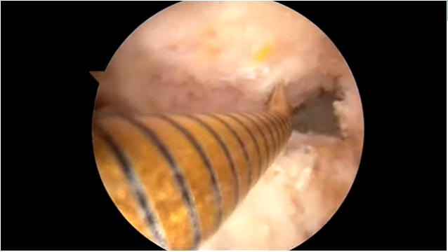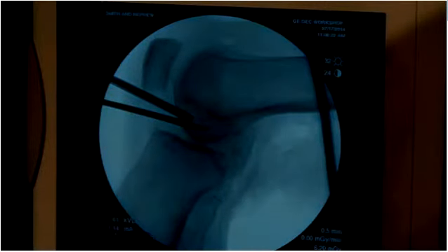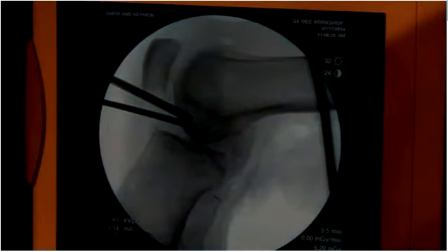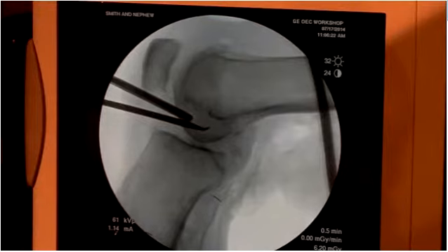Can you show us the fluoroscopic views? There we go. Do you have that fluoroscopic image? Yes, we can see it now. Okay, so you see the nice continuity from the posterior cortex. So now I'm going to go to what I think is the center of the AM. So there's the arthroscopic view. And I would say about there. Fluoroscopic image now, please.